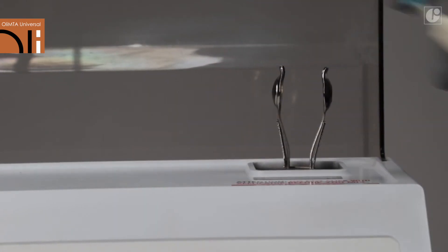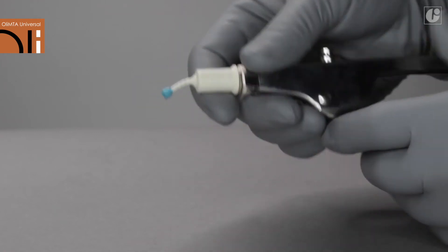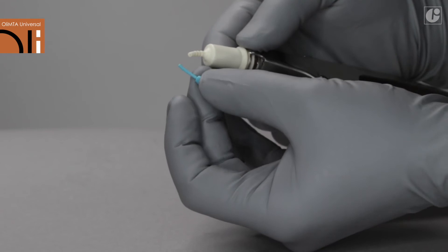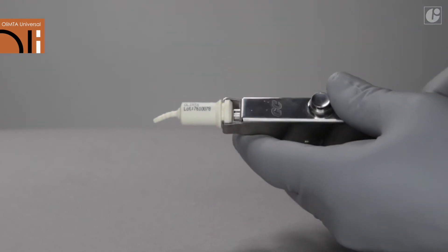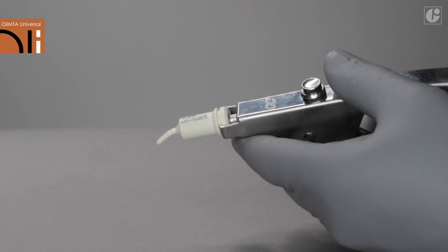After mixing, place the capsule once again in the applicator, remove the security pin and press the trigger twice. You will hear two clicks. The material is ready for use.